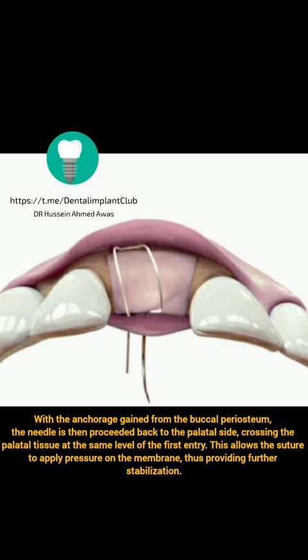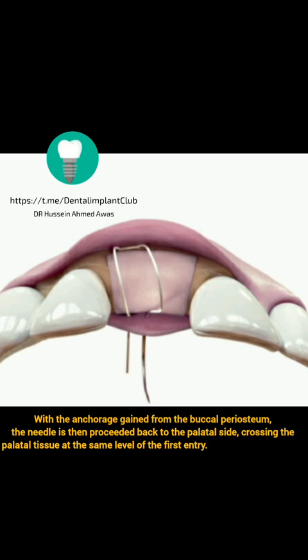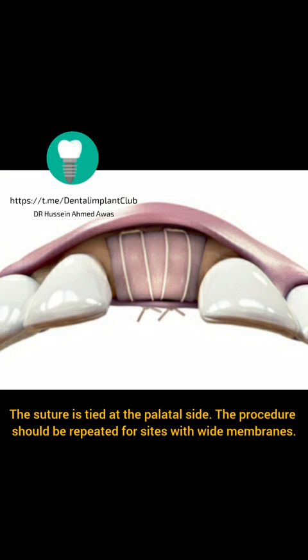This allows the suture to apply pressure on the membrane, thus providing further stabilization. The suture is tied at the palatal side. The procedure should be repeated for sites with wide membranes.